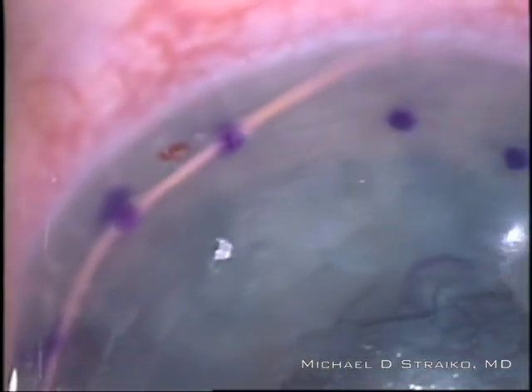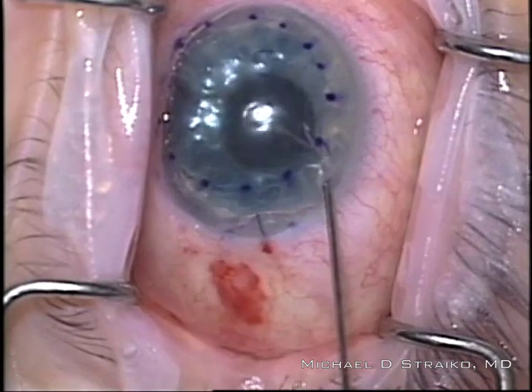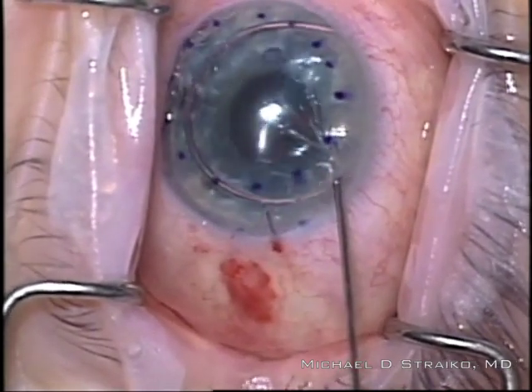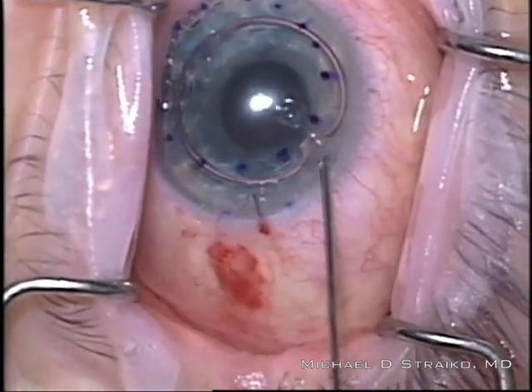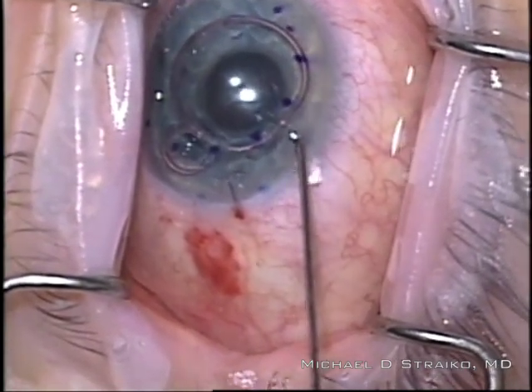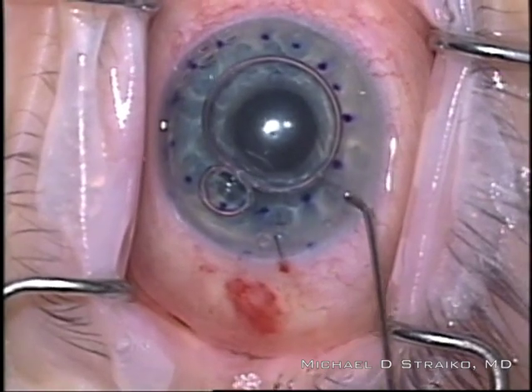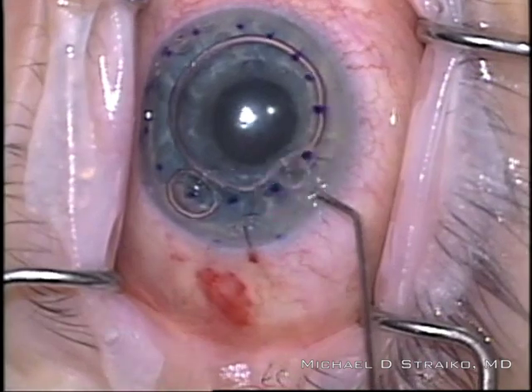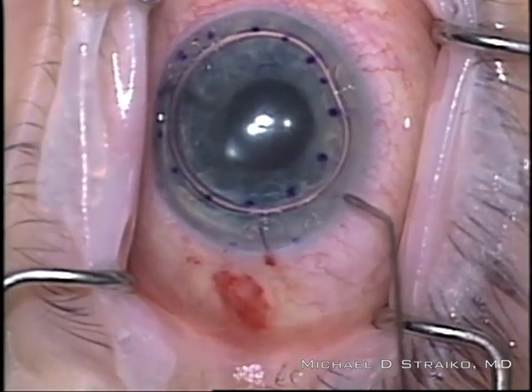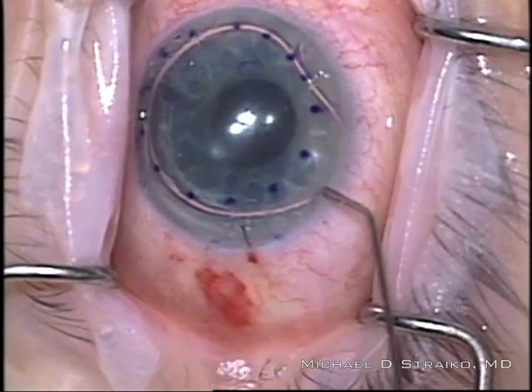Looking at the graft edges, you can see there's a very minimal area where the graft does not overlap any of the host Descemet — just a real thin spot of bare stroma — that'll fill in with endothelium quite quickly. Now I'm injecting balanced salt solution into the pupillary area to make sure there's no gas trapped behind the iris. The iris is staying nice and flat, not being pushed forward. I'll titrate the SF6 gas bubble to about 80 to 90% fill of the chamber, so I know that when she sits up, that inferior PI will be open and will prevent pupillary block.